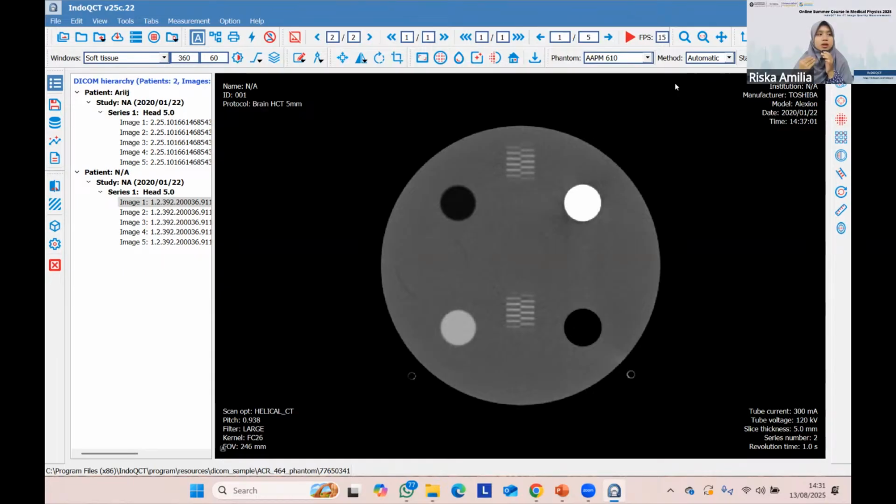Okay, coming back to talking about the TCM, in some cases the info only records the set tube current. You have also published a paper about the TCM DICOM, and the fluctuation affected by the TCM may not be recorded by the DICOM.